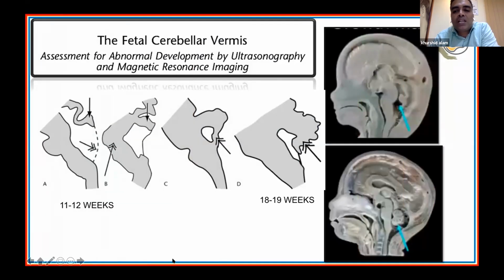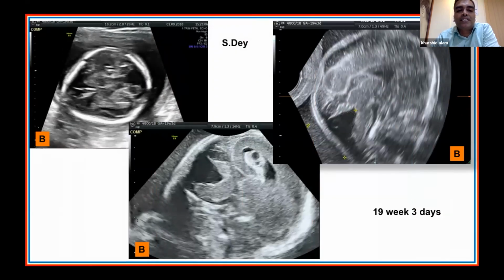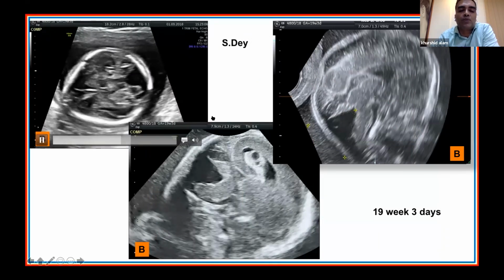because we cannot fast track the embryology, because the vermis starts forming and then it rotates clockwise to close the fastigium or the fourth ventricle, which happens only by 18 to 19 weeks. So if we have to classify based on the vermian pathology, we have to wait till 18 to 19 weeks. And this we explained to the couple, that it could be a benign finding also. So we don't want to overcall, and let us see you back between 19 to 20 weeks. So the patient came between 19 to 20 weeks.